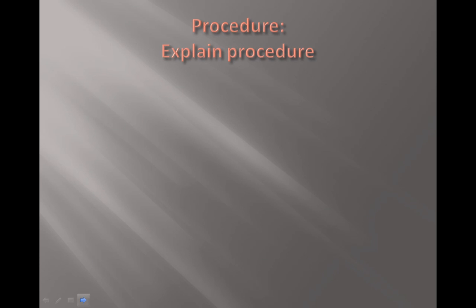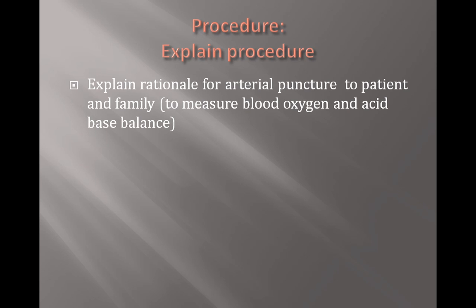Take time to explain the procedure and answer any questions for the patient and anyone else at the bedside. This goes a long way to alleviate anxiety, promote compliance with the procedure, and also achieve success. You can begin with a simple rationale for the procedure and tie in any individualized concerns that you may have. For example, Mrs. Smith, we want to check on your blood pH and carbon dioxide level to see if you're breathing well enough now to go back on your other mask and help you get more comfortable.